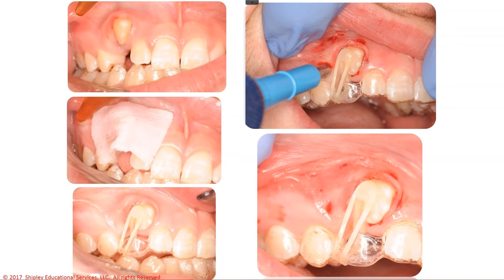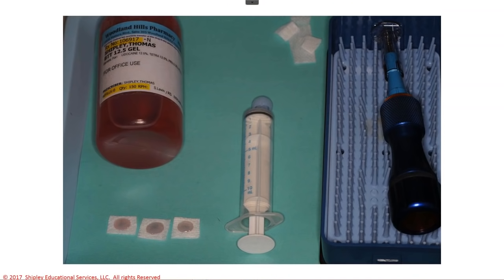In this case, I did 3 mops distal, 3 mops mesial of the canine. We're going to bootstrap it down into position, and that tooth came down in 2 to 3 months with the mops and the bootstrap. So last time the gauze was too big, this time it's too small. But I do want to make a note that this would be the right size gauze if we have done the strips to begin with.